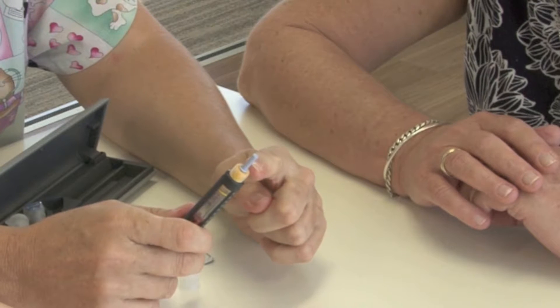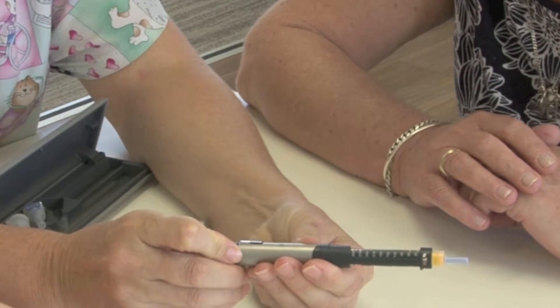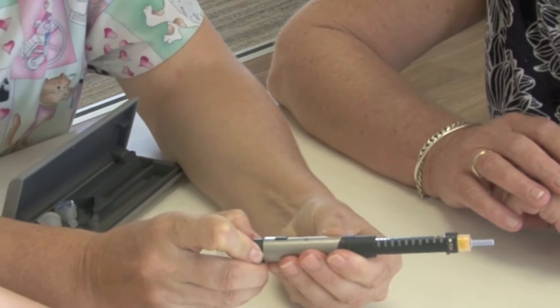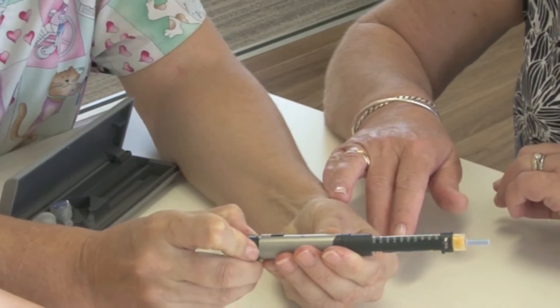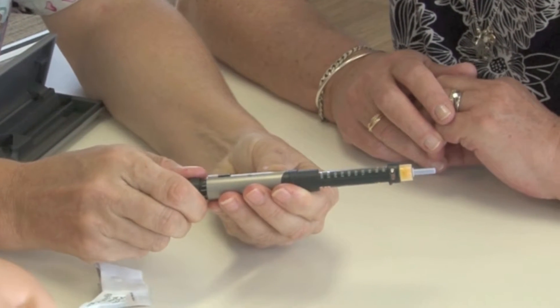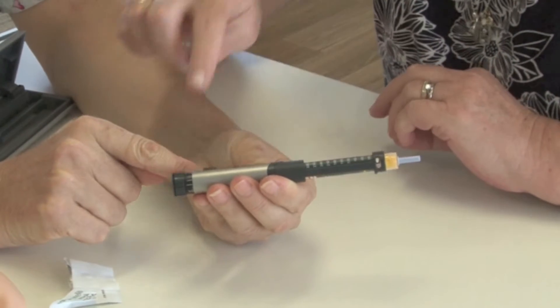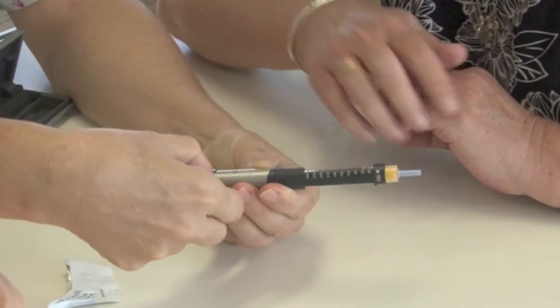There's still a safety cap there. You would then dial up the insulin. How many units are you on? Twelve. Is that a lot? No, not really — you can take a lot more than that. Of this particular type, not a great deal. So we've dialed it to twelve units — the twelve has to be where that little line is. Yes, see the little line there? That's great.